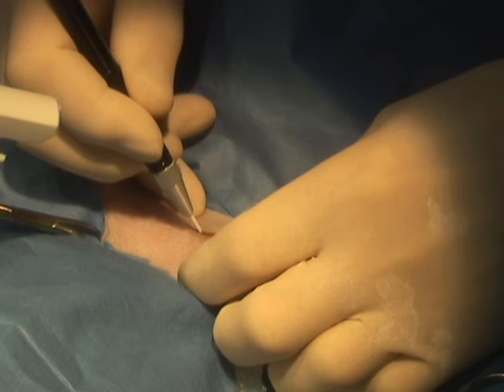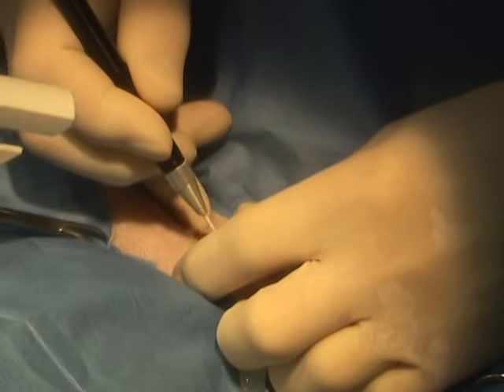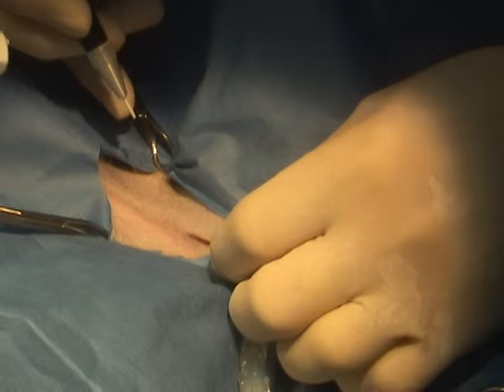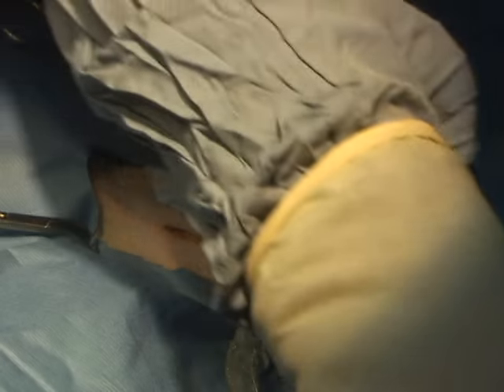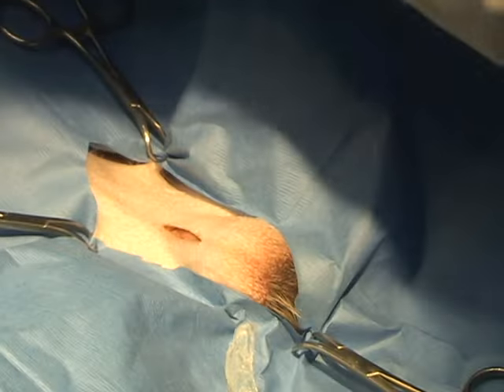If we were just using a regular Ultra Plus Neuticle without an epididymis, there probably would be a risk of movement if it wasn't anchored properly. But because we have an epididymis on this, we will be able to anchor the Neuticle in proper position. We do not have a pre-existing area for the testicle to go in, so we will blunt dissect the area.